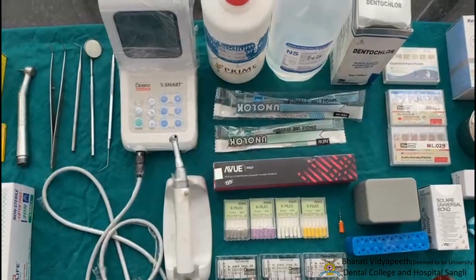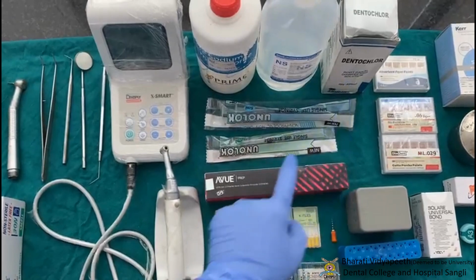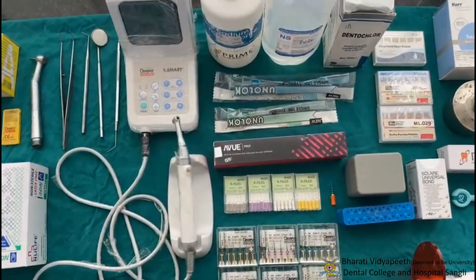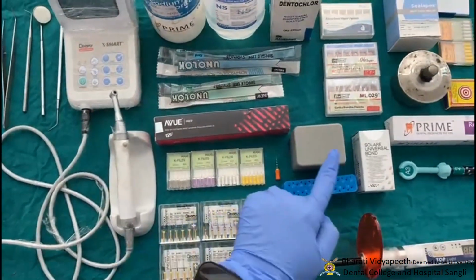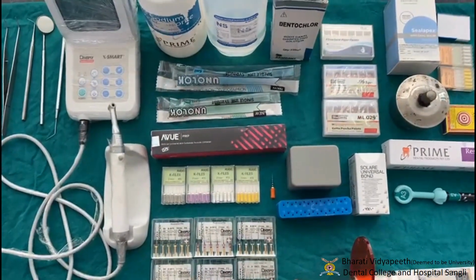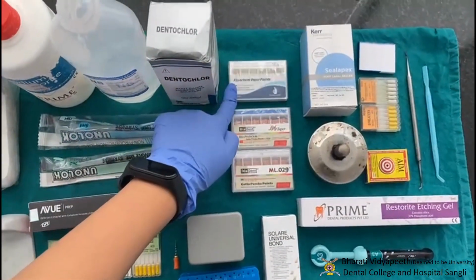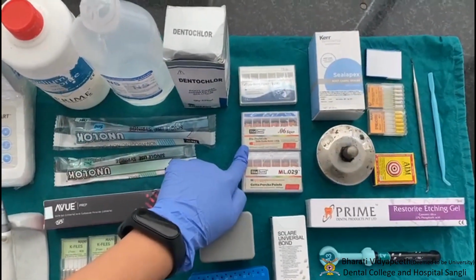After that, the tooth is irrigated with sodium hypochlorite, normal saline, and chlorhexidine with the help of 2 and 5 ml syringes. After determining the working length, the biomechanical preparation is started with the help of an endomotor and rotary instruments. These are the endo boxes and the endo gauge, which help in the biomechanical preparation and measuring the length of the files. After the biomechanical preparation, the canal is isolated with paper points, and then proper master cone selection is done.